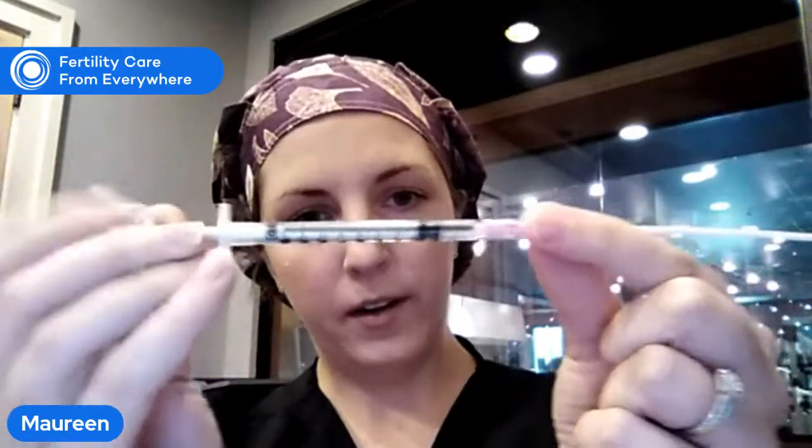So when the nurse tells us that we're ready to load the embryo, we have a big syringe. And in your transfer dish, it's going to be this well here. We have media that's safe for the embryo that we suck up to rinse the catheter, so it's all clean and ready to go. And then we have our smaller syringe, which helps us monitor how much fluid we're loading the embryo with, because we want a very specific amount.